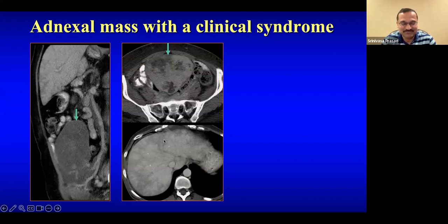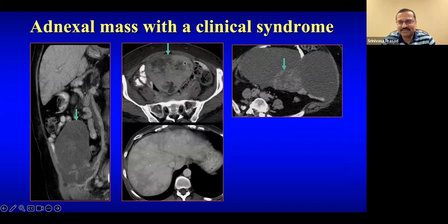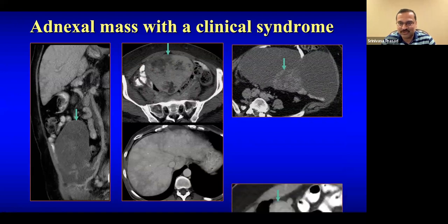But this patient had presented with carcinoid heart syndrome, classic findings of passive hepatic congestion with a heterogeneous midline mass. And this patient with hyperthyroid symptoms was found to have a struma ovarii.